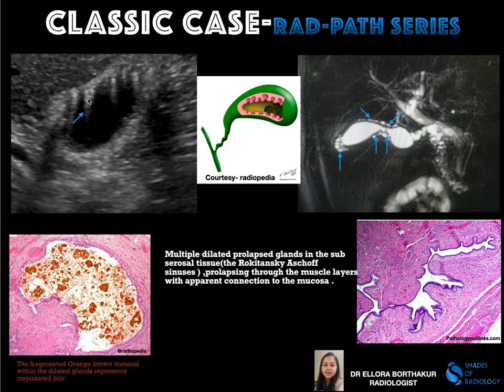These ring-down artifacts are mainly due to the inspissated bile within the Rokitansky-Aschoff sinuses, which are significantly dilated in cases of adenomyomatosis. This is the classic case — the inspissated bile causes ring-down artifacts within the dilated Rokitansky-Aschoff sinuses. Similarly, on MRCP, the dilated sinuses appear as cystic areas along the wall of the gallbladder, giving the classic 'pearl necklace' appearance.